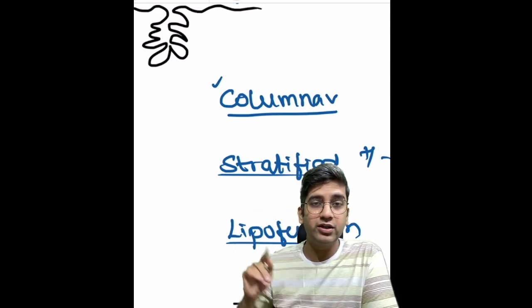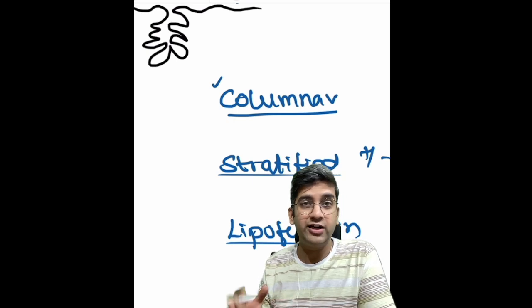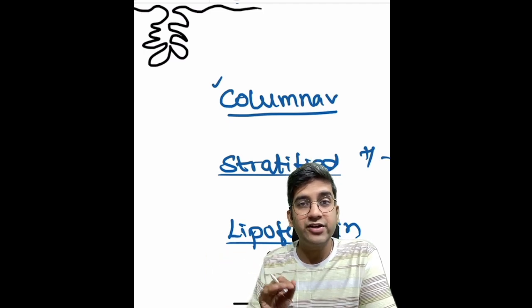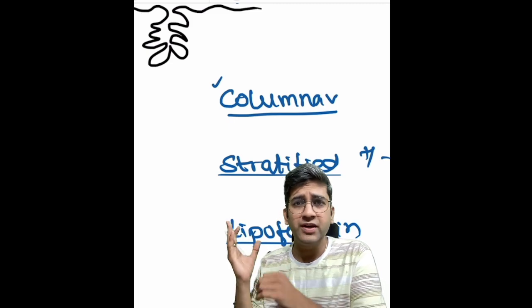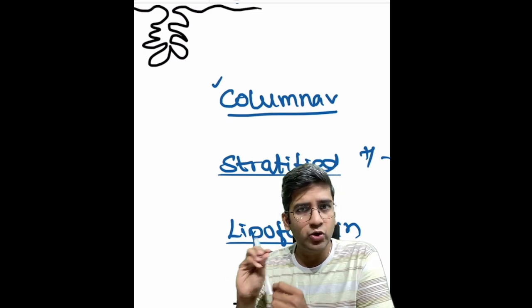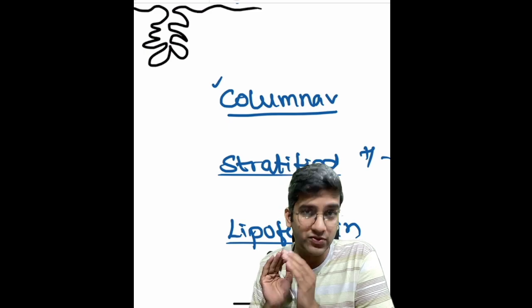Why this is important is you should not mistake it for hyperplastic epithelium, because stratified epithelium in a biopsy of colon, we used to think of something wrong, right? So here, stratification can be normally seen based on the axis of cut. Sometimes stratification will not be visible. You might see a basal layer which will look darker and a columnar layer on top of that, and stratification is completely normal in case of seminal vesicle.